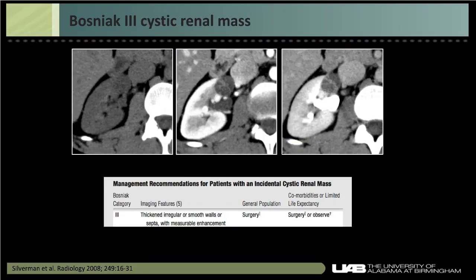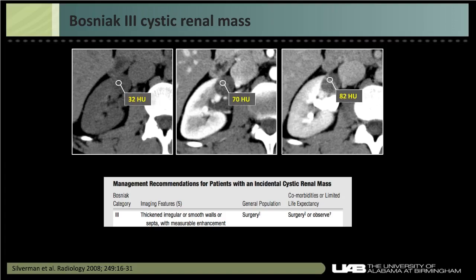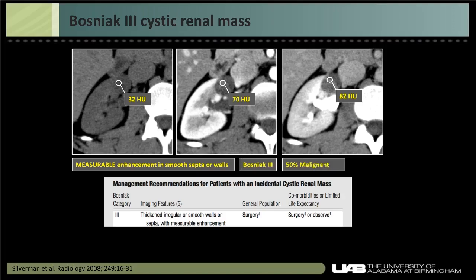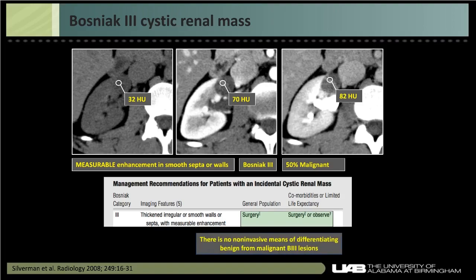Bosniak 3 renal cysts have measurable enhancing components in walls or septa. For example, a thickened septation measuring 32 Hounsfield units on non-contrast and 82 on nephrographic phase — an increase of 50 Hounsfield units, well above the 20-unit threshold — confirms measurable enhancement. About 50% of Bosniak 3 lesions are malignant. There is no non-invasive means of differentiating benign from malignant Bosniak 3 renal lesions, which is a significant challenge.